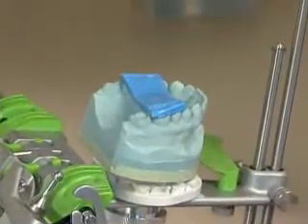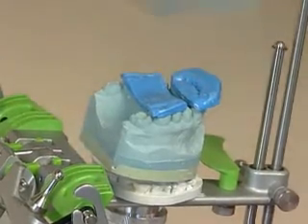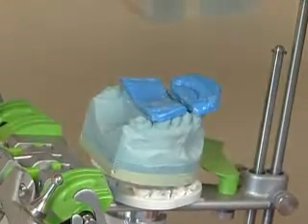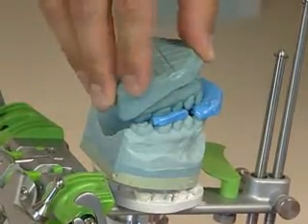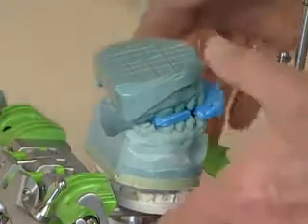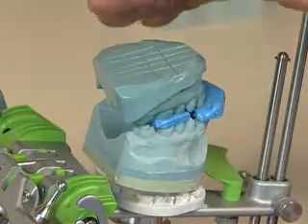Make sure your wax bites fit good. And now we'll put our lower model on. Make sure it's seated good, and so you kind of take it and put a little pressure on it, right over the top of it. And it's not quite parallel.